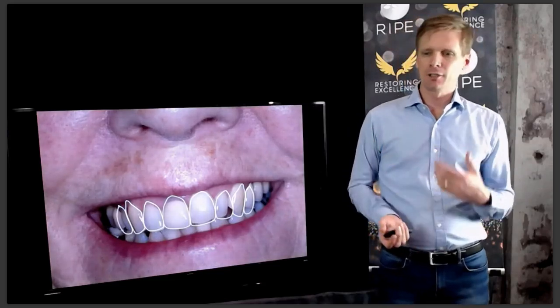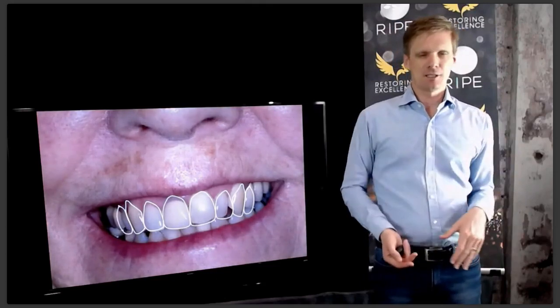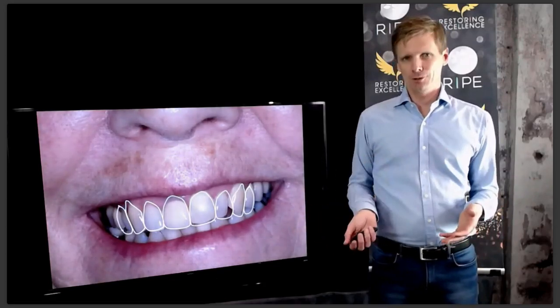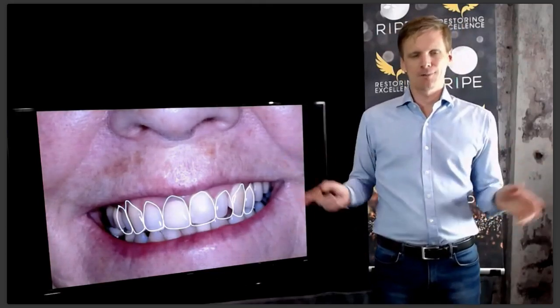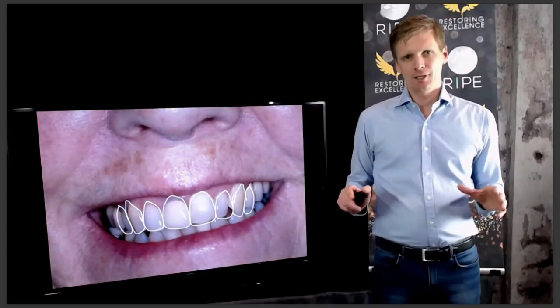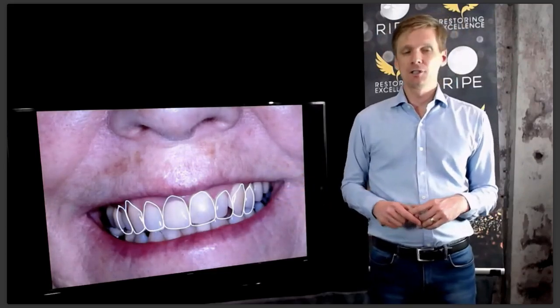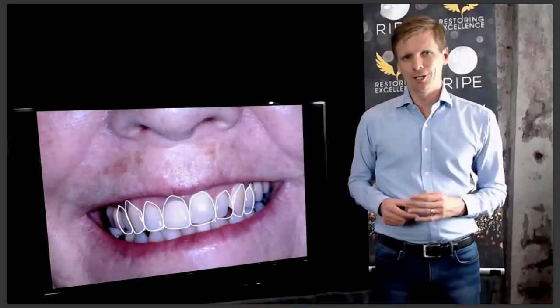Now, if you look online or on Facebook or on people selling courses, they will show you where they did a smile design and then the technician did it, and it always works perfect every time. The reason it works perfect every time is because they're not showing the cases where it doesn't. It's very easy to make something work all the time: never show anyone the ones that don't work. I have done digital smile design in many ways, and you never get it 100% of the time. So on easy cases like the last one I showed you, it's easy to get it fairly close. But on cases like this, often you're going to need to adjust your temporaries and so on, which is why you need to know what teeth look like.